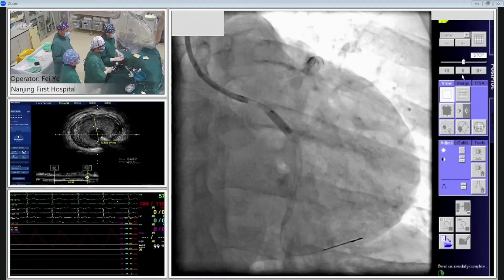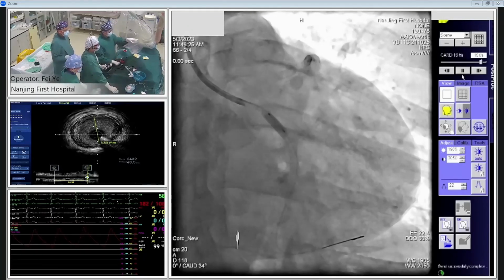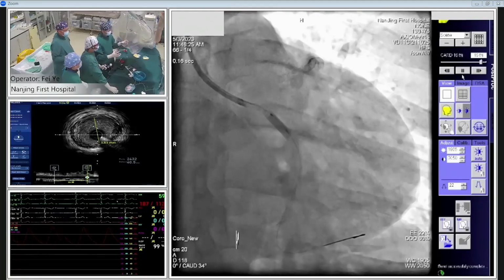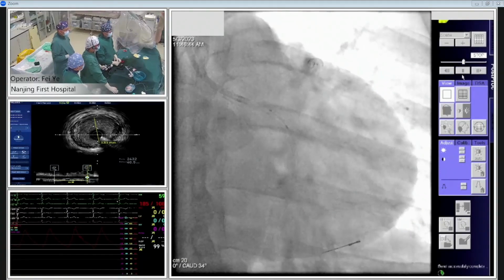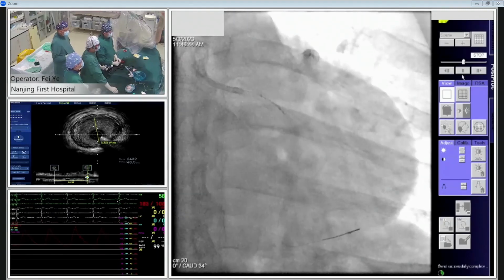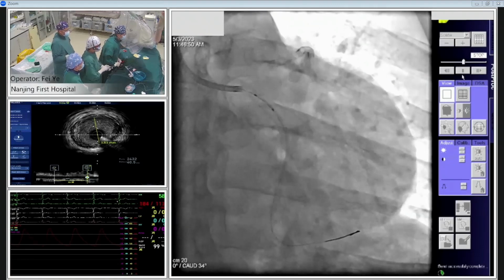Just because, okay, down, we can see the NC balloon shoulder was very long. Even though we make a precise position, with the balloon inflation we can see the shoulder of the balloon extend so long, making the POT position extended over the precise position, okay.